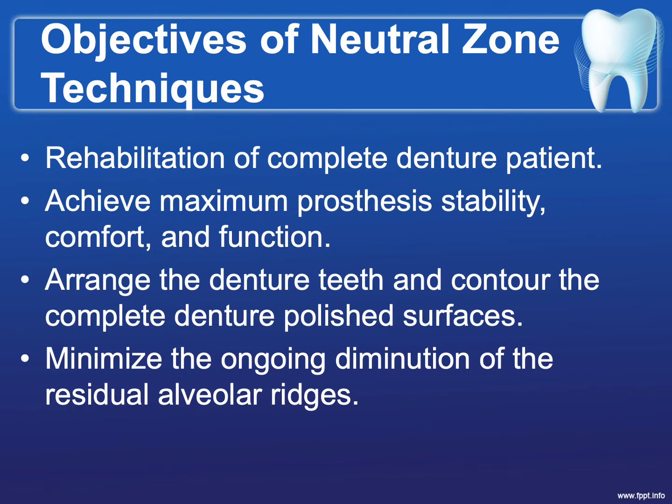Objectives of neutral zone technique: rehabilitation of complete denture patient, achieve maximum prosthesis stability, comfort, and function, arrange the denture teeth and contour the complete denture polished surface, and minimize the ongoing diminution of residual alveolar ridge.